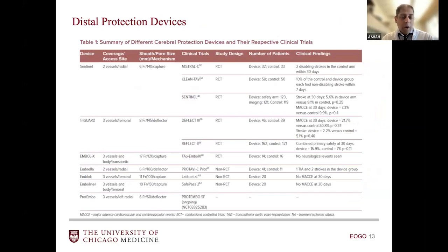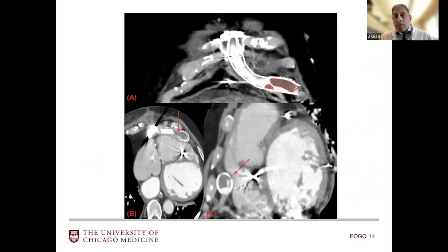Again, I just throw this slide in there. This is a ripe area of discovery, not only for outflow graft obstruction, but primarily also for TAVR and other aortic interventions. Here's an example of clot.